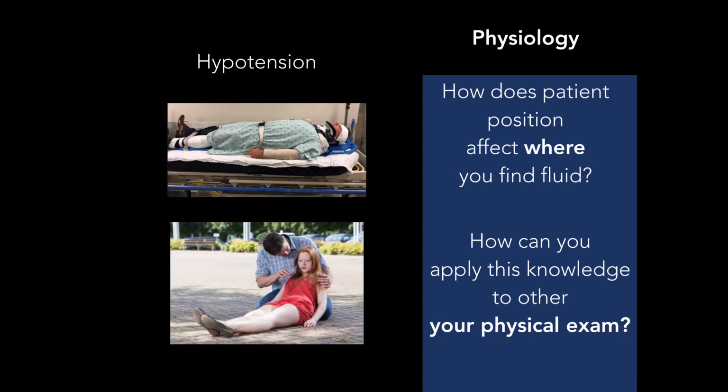All right, let's take it one more time. So the things I just taught you is free fluid is gravity dependent, so you find it in different places depending on how the patient is. Plus, it helps you in your physical exam findings know what you're thinking, and it helps you apply your physical exam. But here is my trauma patient. They're laying flat, so gravity is not affecting their blood pressure. In other words, fluid and also your organs are affected by gravity. If I'm laying flat, the gravity is equal all the way up and down.